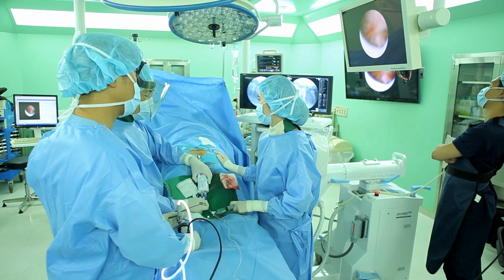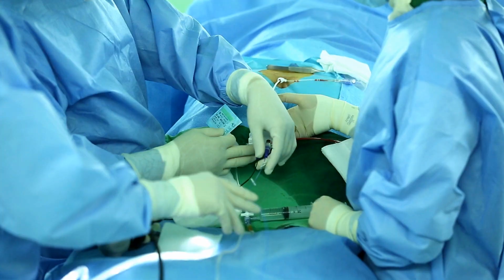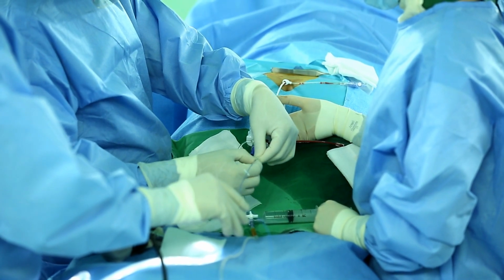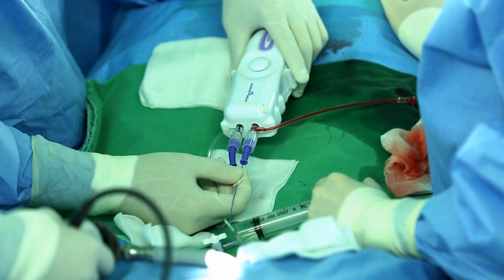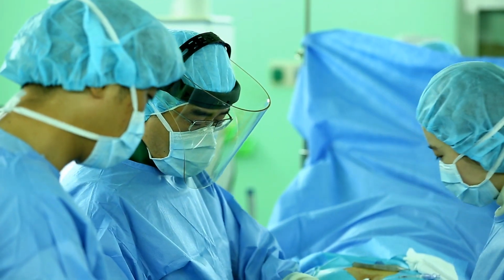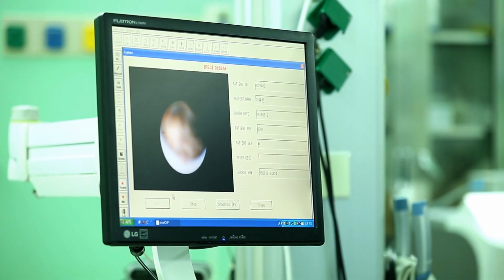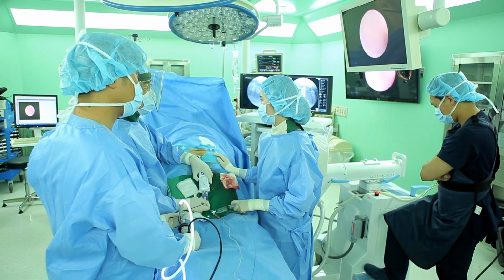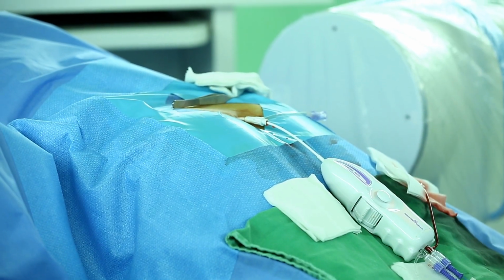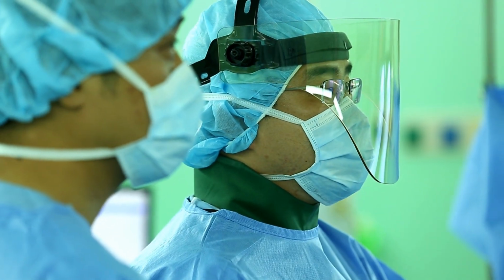This procedure is almost finished, but you're wondering when to finish this procedure. SELD procedure time fully depends on an SELD surgeon's experience because SELD is a concept of decompression, not total removal of HNP, such as PELD and open discectomy. You should ask the patient before SELD if the patient has pain in the operative position, and it will help you to judge when you should finish SELD if the patient has pain.